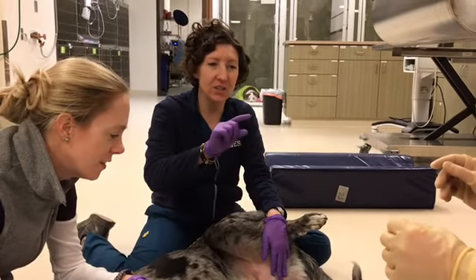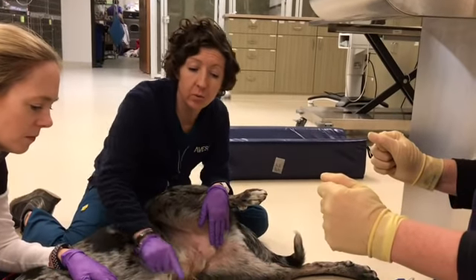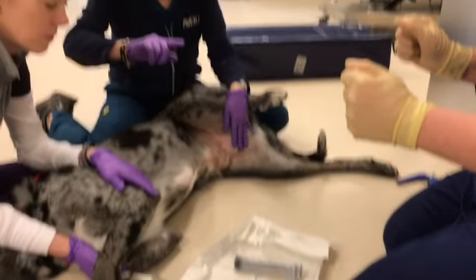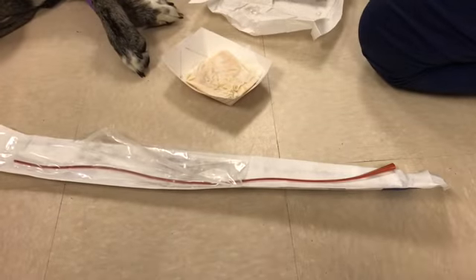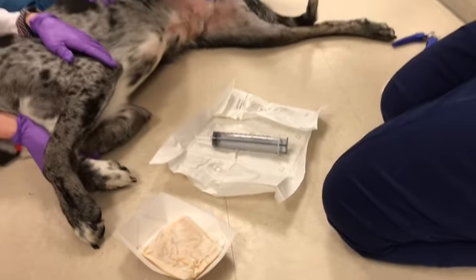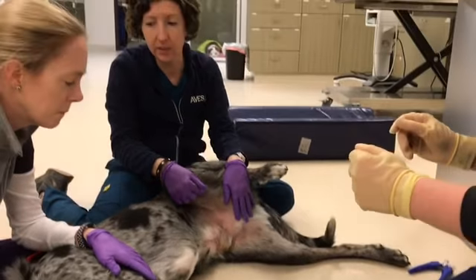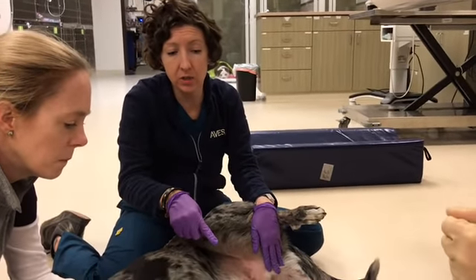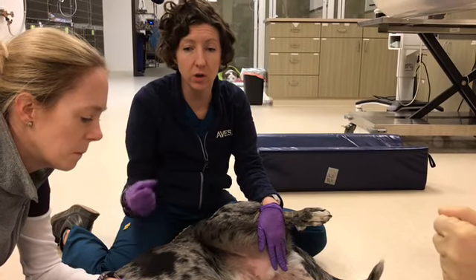She's got her sterile gloves on with a sterile syringe, and then she's going to take the sterile red rubber catheter with sterile lube from her packaging and insert it until we get some urine back, and then she's going to use the catheter to draw out the sample.